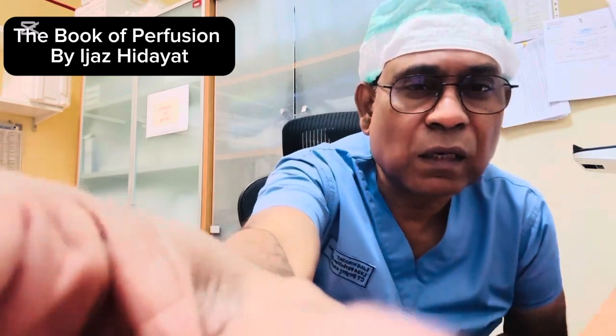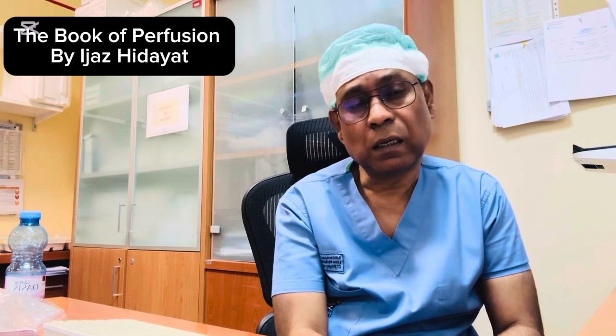So guys, create your own hospital checklist, retrieval checklist. Make your own hospital ECPR trolley. So in case of any activation, you just move your trolley and provide all required medical surgical stuff, and be ready for any emergency, and always keep backup items available.